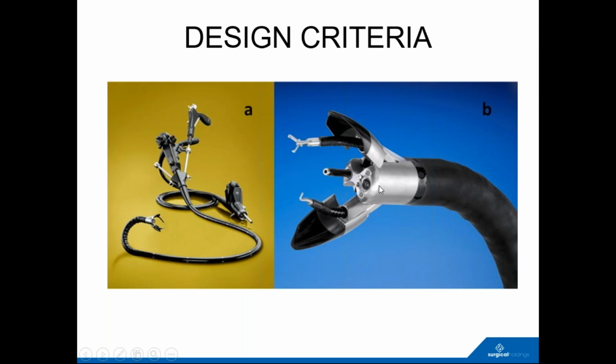There could be a laser fiber coming through here. This is the objective area. This is the lens and the light area. So, quite an elegant design for something which is really looking at more therapy through a flexible instrument, which to me will definitely take off. NOTES didn't take off, but more therapy through flexible endoscopes, I do believe will continue to be developed.